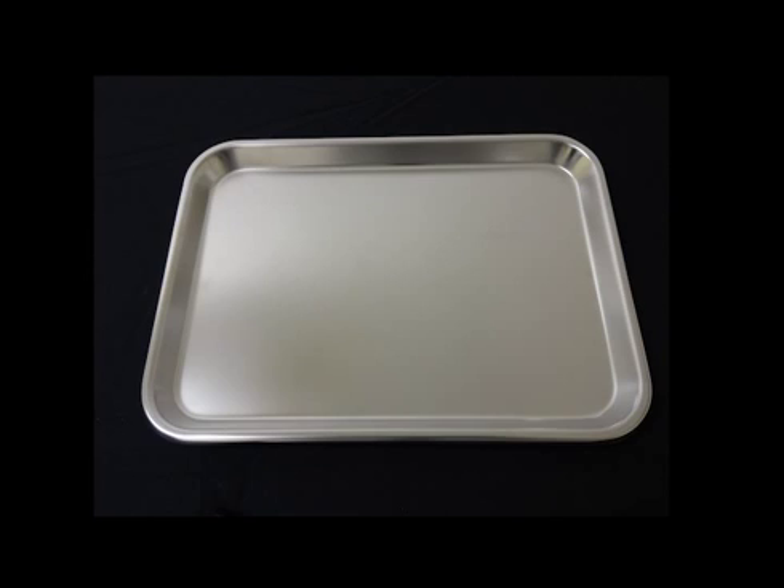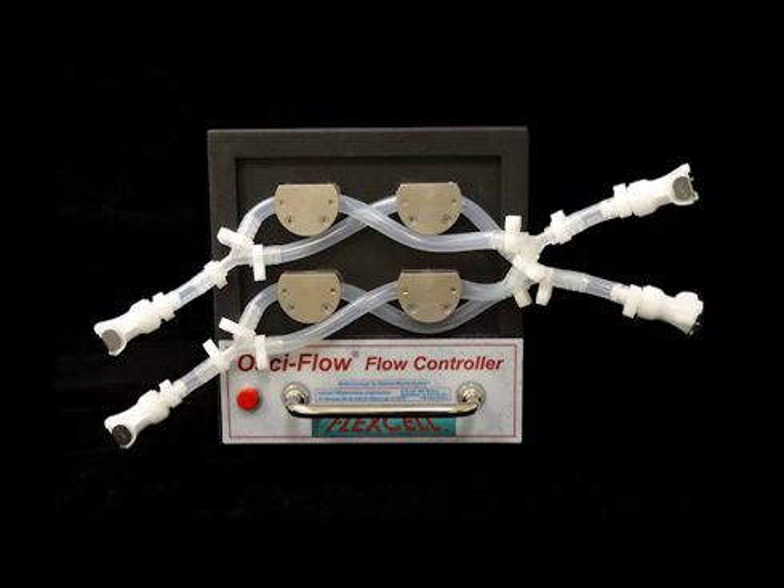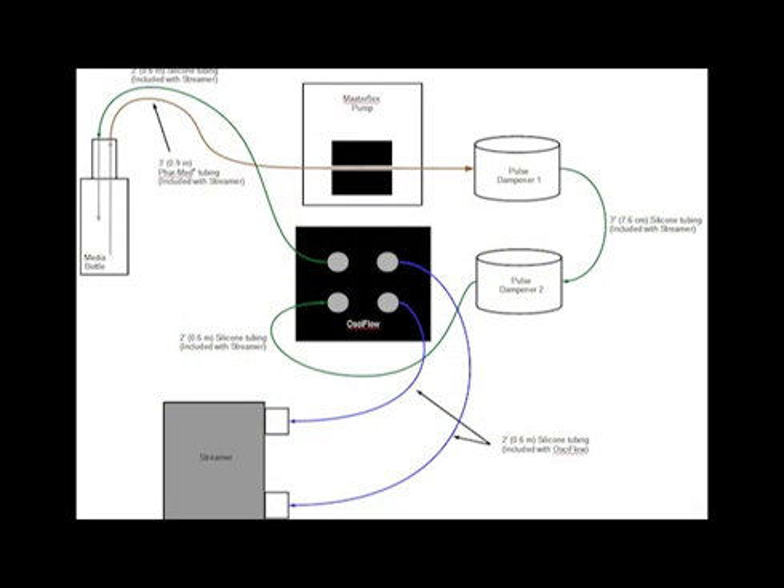The entire streamer system should then be placed onto the silver tray and put into the incubator for use, except for the Ossiflow and the computer. The Ossiflow should be placed on top or beside the incubator, as near as possible to the port through which the tubing enters the incubator. This will minimize the amount of fluid exposed to atmospheric temperatures. Your streamer system with Ossiflow is now ready for use.